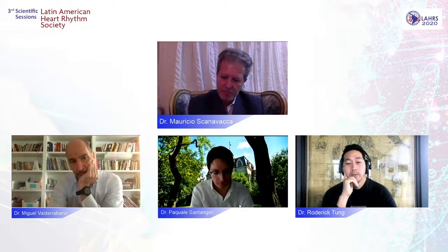Obviously, the esophagus is a problem in the posterior wall, but you can deviate the esophagus, etc. But if you don't prove with the highest output that you can in the middle of the posterior wall, you will miss this information about the presence of epicardial bundles still present, and you can have more recurrences. What is your opinion about it, Rod?